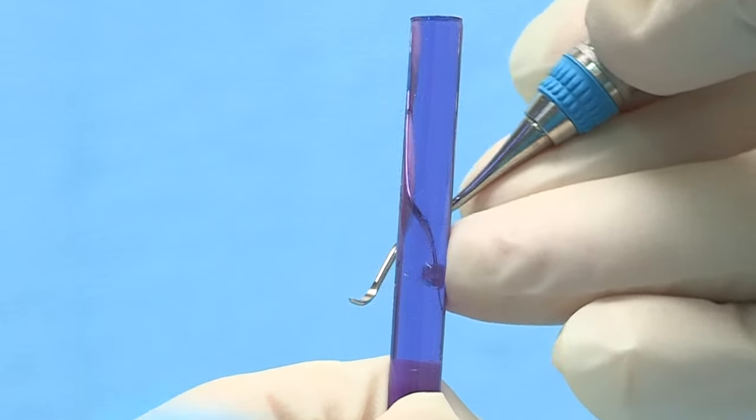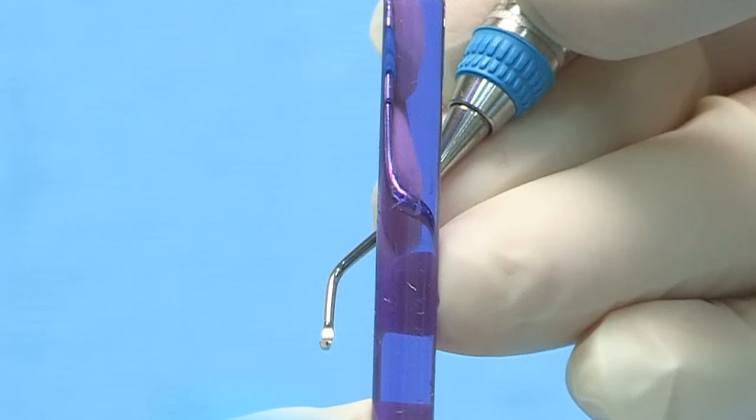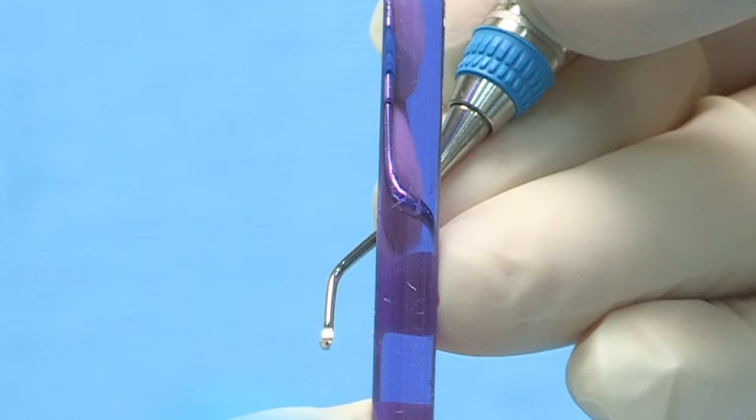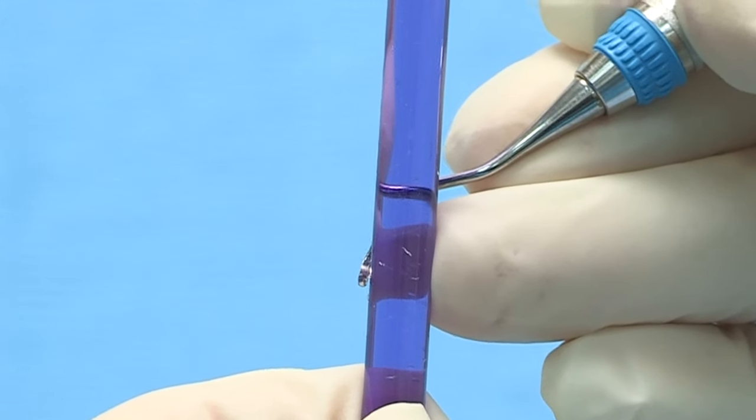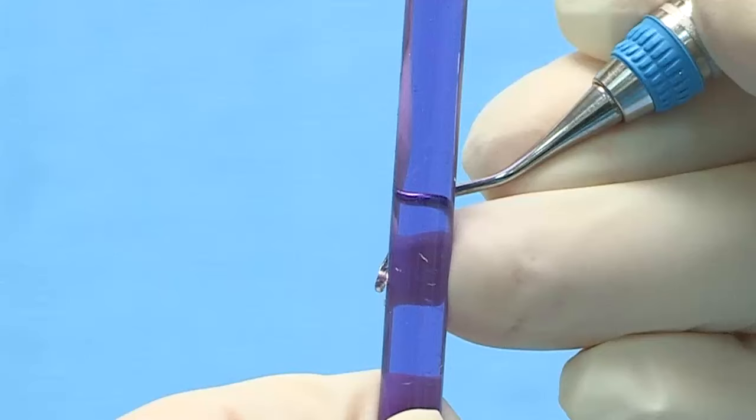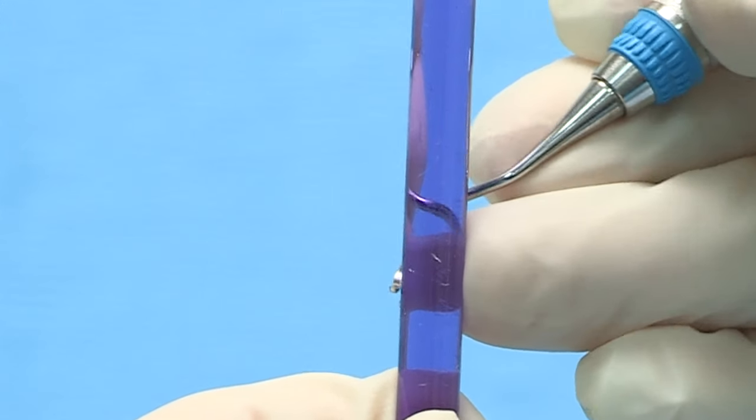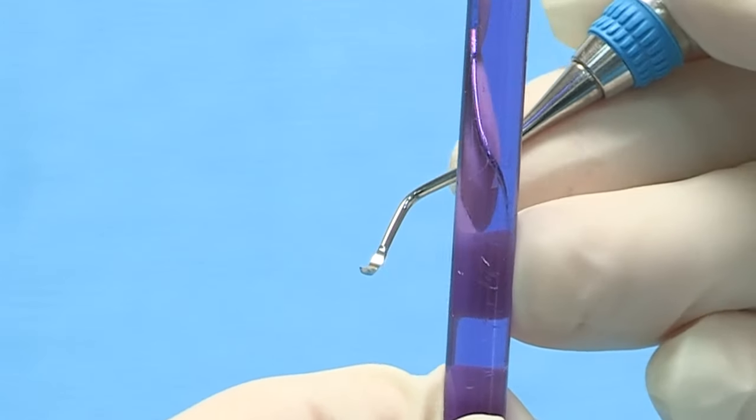Bring the instrument around the back of the test stick with the toe pointed toward you. Place the cutting edge to be tested against the left side of the test stick opposite your fulcrum. Tilt the terminal shank very slightly toward the test stick using the same angle you would use for scaling. Place the cutting edge laterally into the test stick and release.